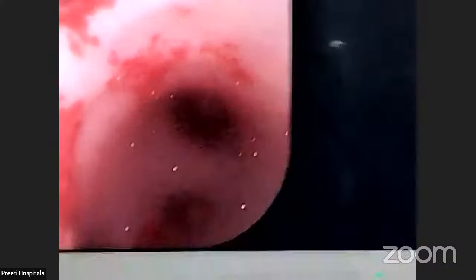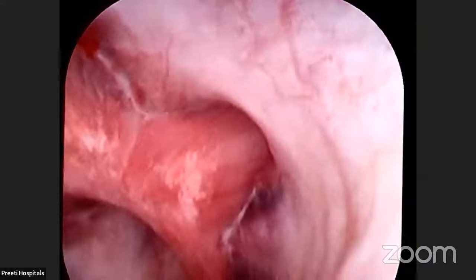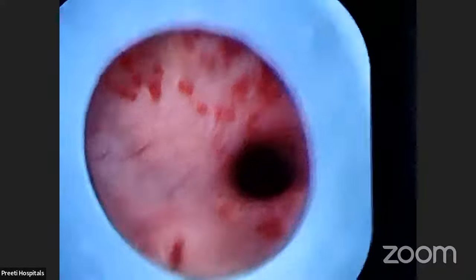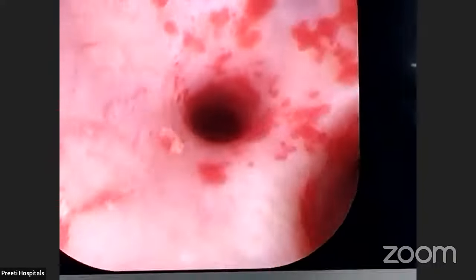Clot also you can suck out. There is no problem in sucking out the clot also if it is a little loose. Now this is the lowest calyx. Yeah. Now come out. That is the lowest calyx. Yes, already we have seen that. Now come back slowly. Keep on sucking. Come back slowly like this and watch the PUJ.